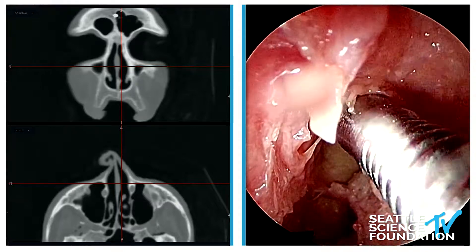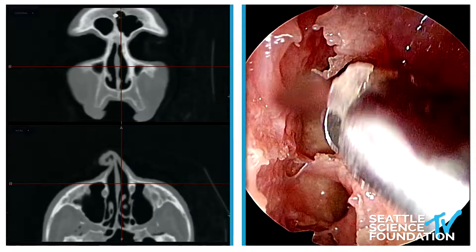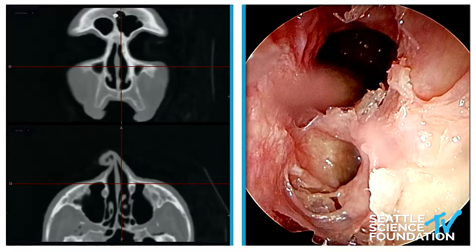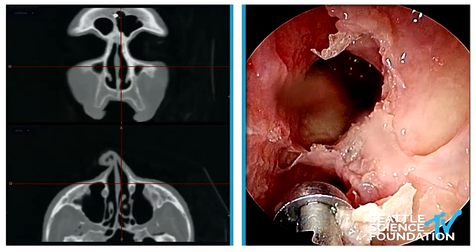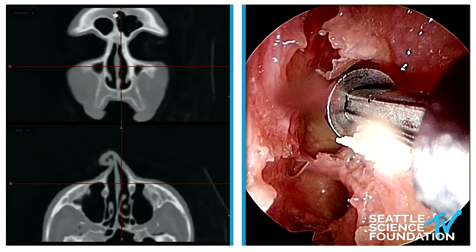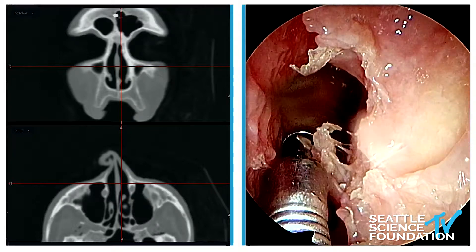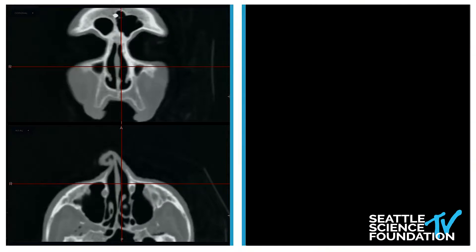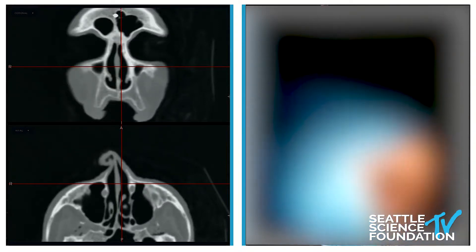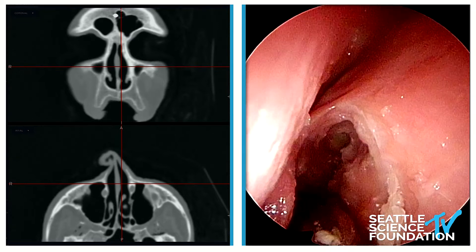I'll try to use the microdebrider to clean up some of those bony remnants. And then we can kind of see that circular aperture into the frontal. We know the anterior ethmoid artery is back here. We found it as one of our four landmarks: middle turbinate, orbit, beak, anterior ethmoid artery. This cellular wall between the two can be improved so that we can turn that into the half horseshoe created by the shape of the brain and the anterior cranial base.